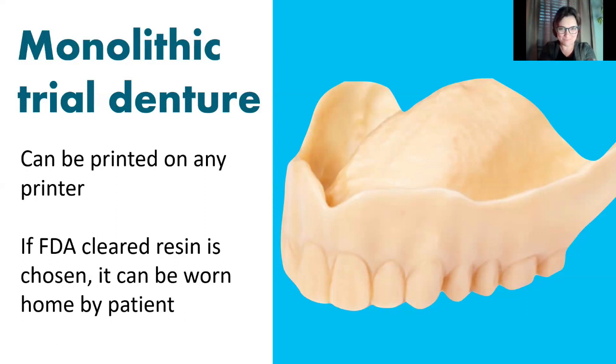Will you sign this paper so that we can process it? And if it doesn't look like what you want, you have to pay for it. And it's just a really intense appointment when you do a wax tooth try-in, and try to get those answers and try to find if that's what your patient wants in that very short amount of time.